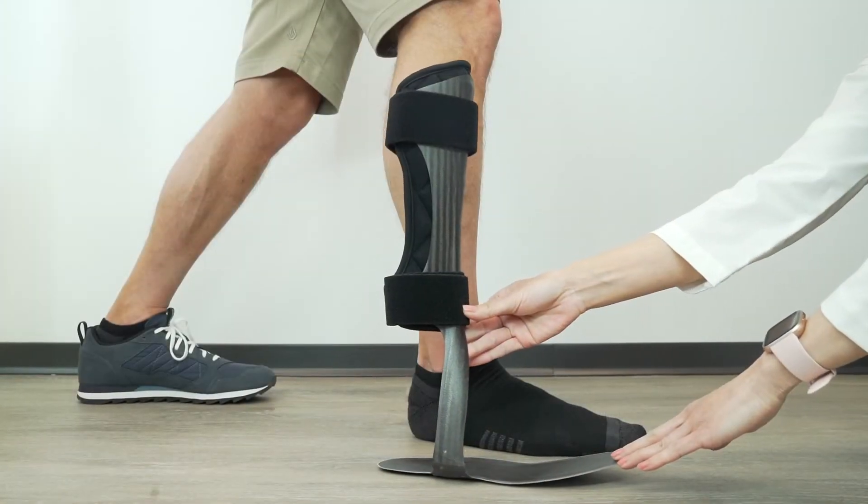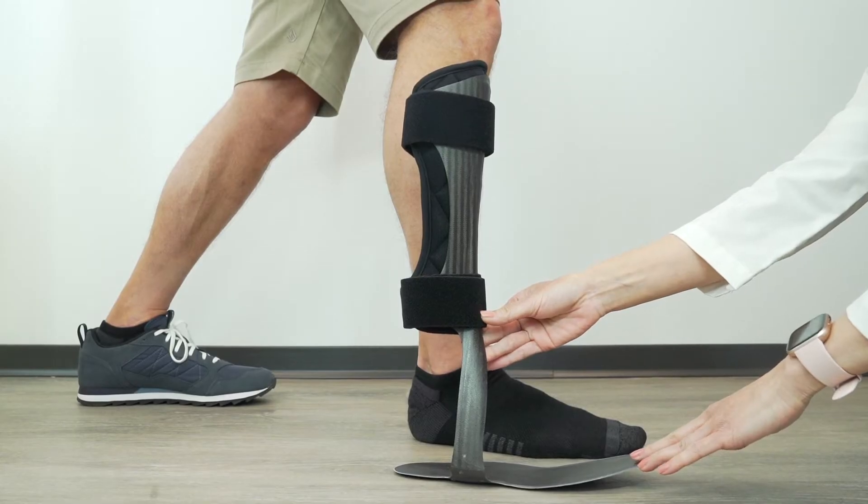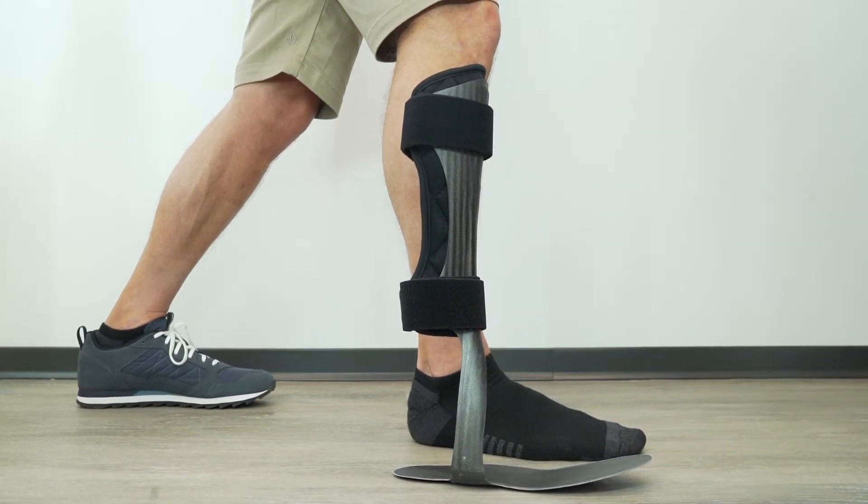The anterior AFO is a little different — it's actually much stiffer. It provides toe clearance during swing phase, but during stance phase it's stiffer so that it holds the shin back a little bit, which allows it to actually control the knee. So the anterior AFO provides toe clearance during swing phase and also provides control of the knee during stance phase.